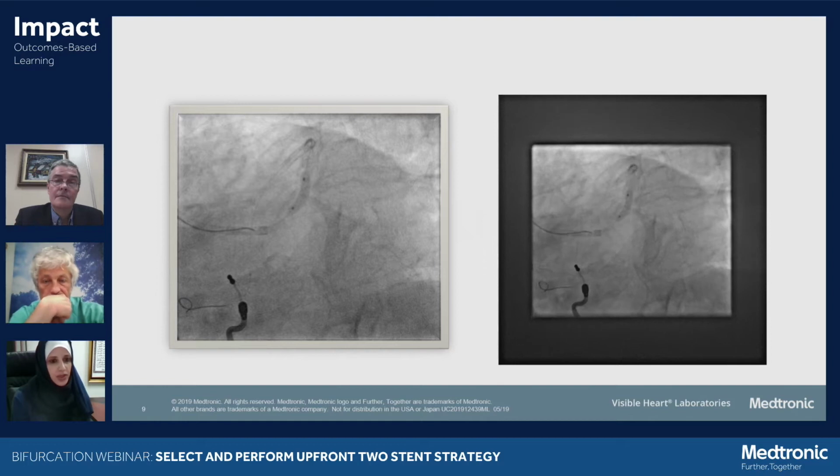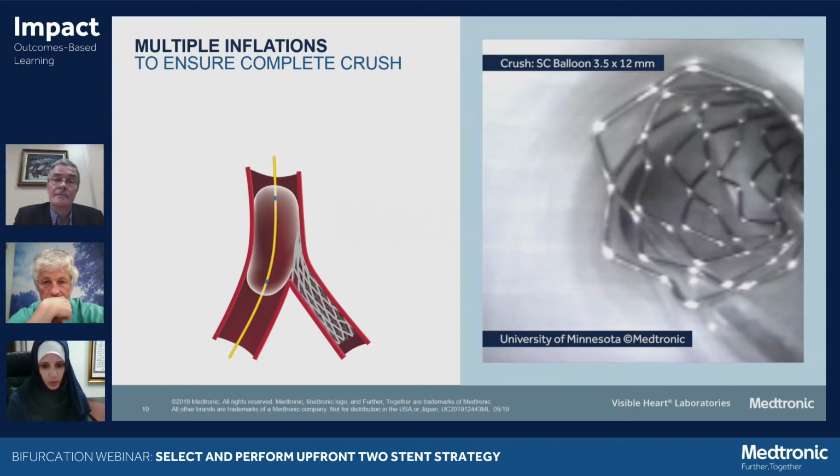The balloon that was across the circumflex in the left main into the LAD is now inflated to do our crush. And, you know, initially when I first started doing these procedures, I was afraid of the crush. But eventually I learned the crush is actually my friend. The better the crush is, the more appropriately sized the balloon, the easier it is to cross back into the vessel that we want. And this is actually from the Visible Heart Laboratory.